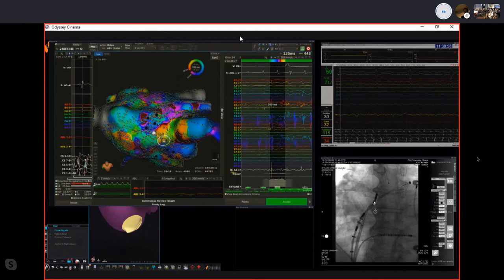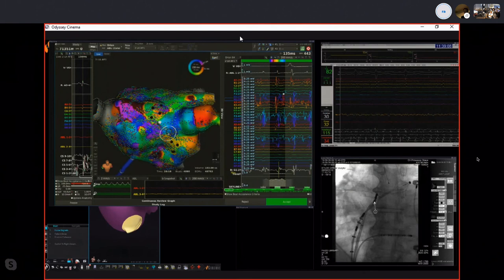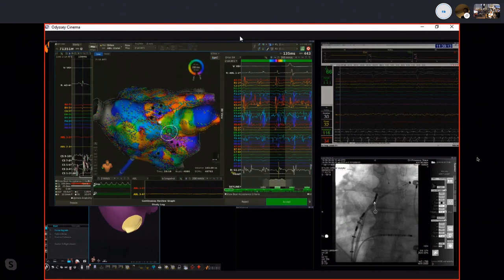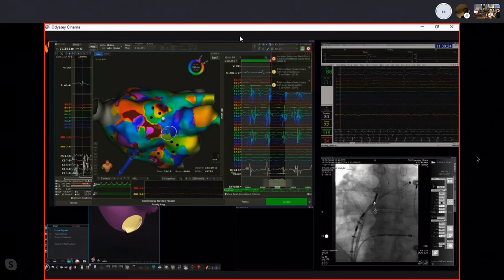And this was the case for this other spot, just at the level of the roof. And you can see once again how nicely the potentials recorded by the Orion catheter are consistent between consecutive beats and cover the entire cycle length. If I take away the electrograms, the electrodes, maybe you can once again appreciate that this spot, for example, has this rotational activation pattern around it.